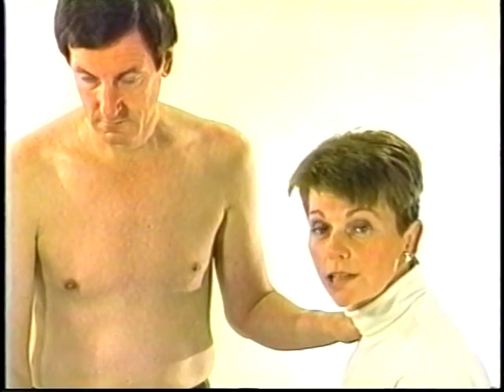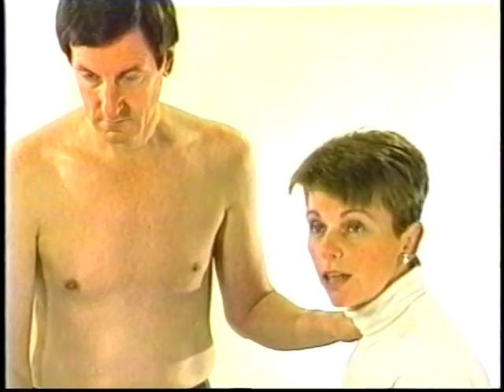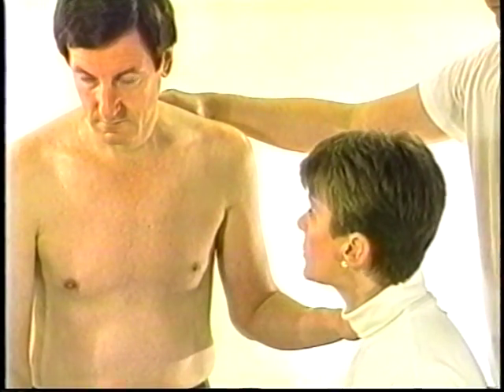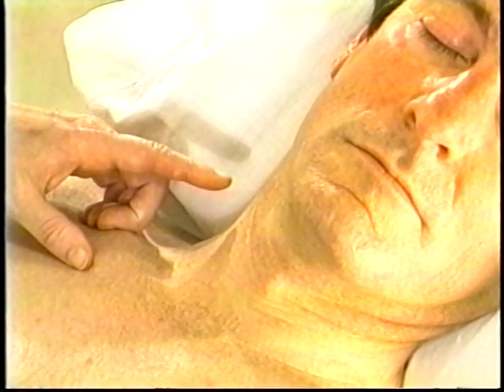It is important that the patient does not move away during the procedure. This can be prevented by giving the patient support in the upper back area. Another challenge is represented by masses under the sternocleidomastoid muscle. These may be large, causing the muscle to bulge, or small and difficult to detect under the muscle.